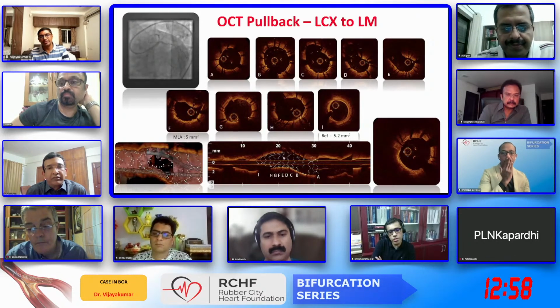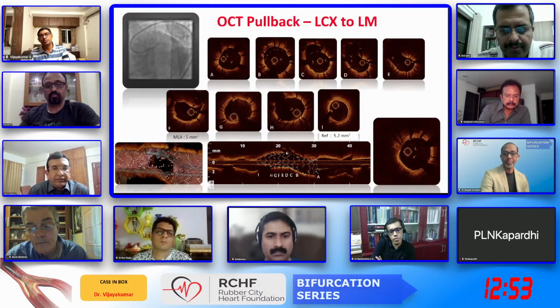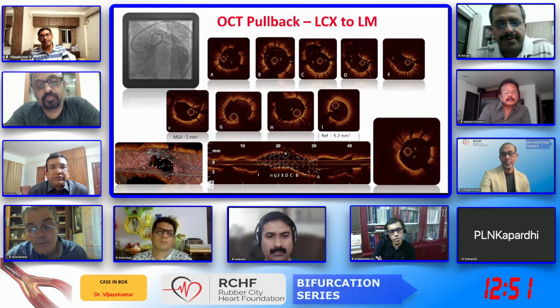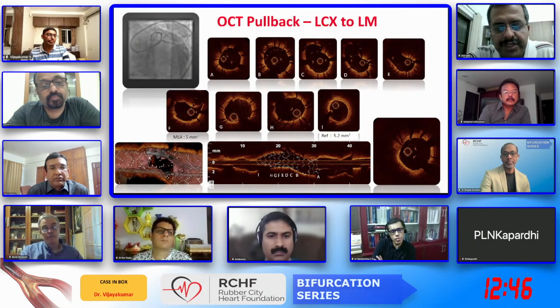And it looks like the stent morphology is favorable. You can just see here, there is a connector here. Most probably this is a connector-free cell. Sir, can you just elucidate for everyone which is your preferred cell to cross or strut to cross?